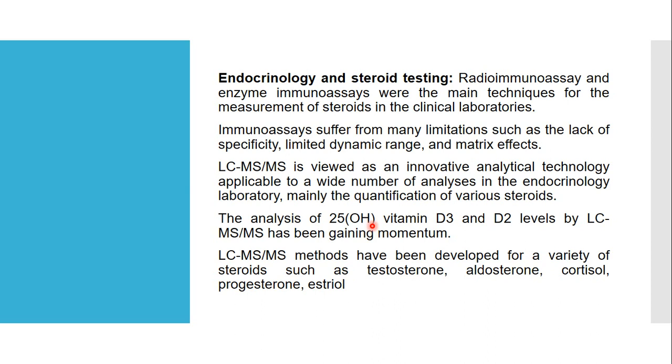Next application is in the field of endocrinology and steroid testing. Radioimmunoassay and enzyme immunoassays, they were the main techniques for measurement of steroids in clinical laboratories. But they have limitations like lack of specificity, then limited dynamic range and matrix effect. So nowadays, LC-MS is viewed as an innovative analytical technology applicable to a wide number of analyses in the endocrinology laboratory, mainly the quantification of various steroids.